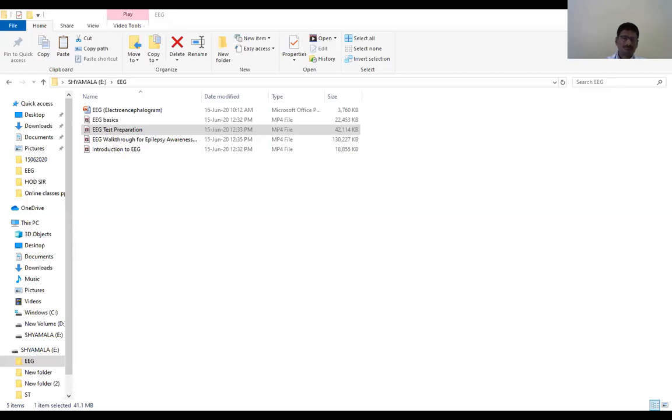For help in the analysis process, our EEG machines are equipped with digital video recording so that the doctors can correlate brain activity with the patient's clinical manifestations. Now we can begin with the lead removal and cleanup process. We make every effort to remove all remnants of any of the adhesives used from the hair and scalp.